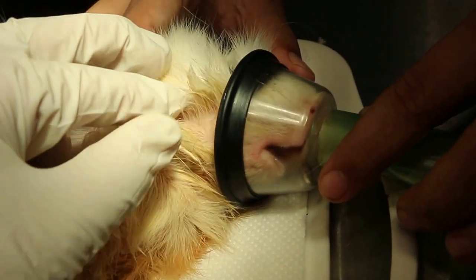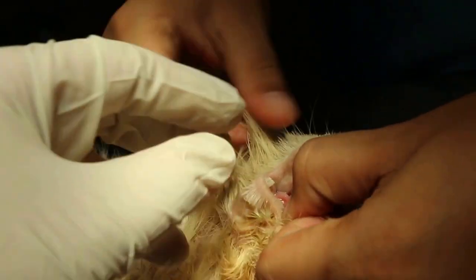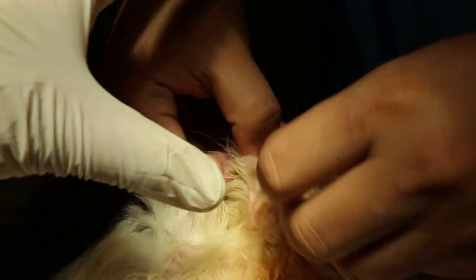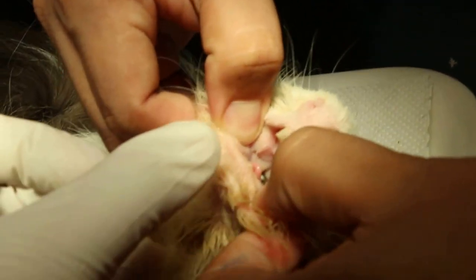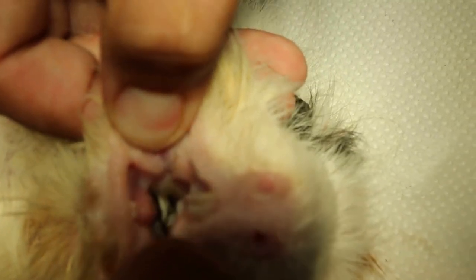Now we give some anesthetic and I will show you the molar spur. There is something sharp, curling downwards — this is the molar spur.